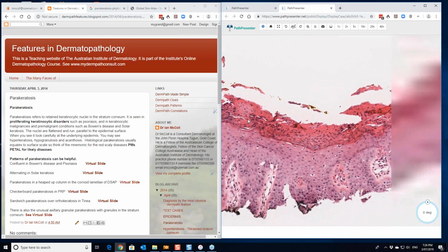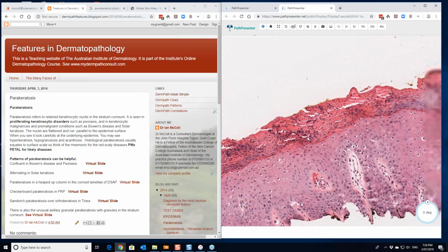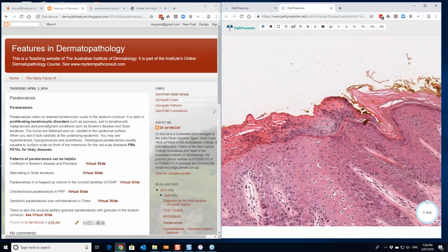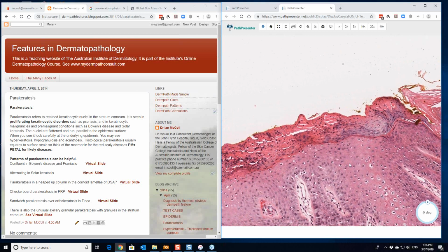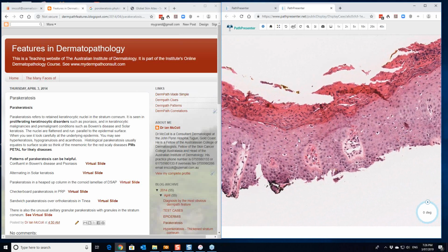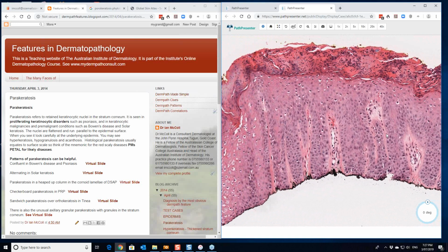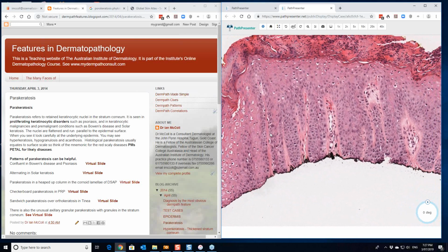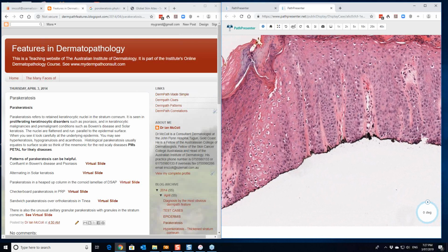And then if we move further along again, we're still in parakeratosis all the way there, and then we start to get into areas of orthokeratosis. So that's the alternating pattern of orthokeratosis and parakeratosis in some superficial spreading type solar keratoses. You might argue there's almost full thickness atypia there, and it's really Bowenoid.